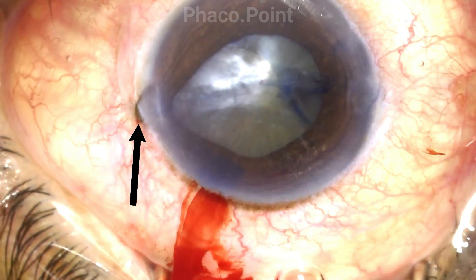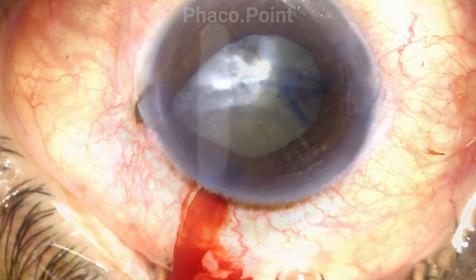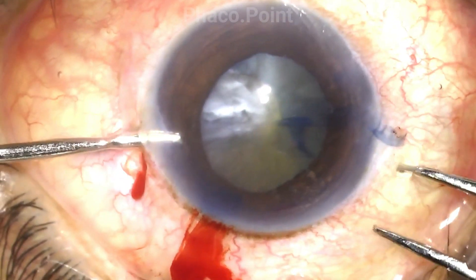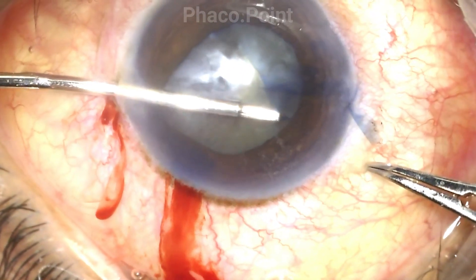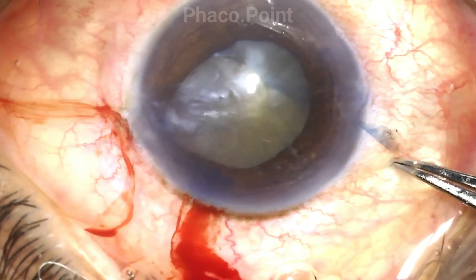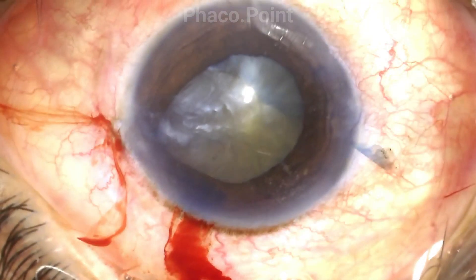I'd also like you to notice the tendency to iris prolapse from these rather large side port incisions. With the help of a little viscoelastic, the iris is repositioned, after which the intraocular forceps is introduced from the left side and the capsular rhexis is completed. You will notice that you've ended up with a fairly eccentric rhexis. A capsular rhexis like this could result in the nucleus tending to pop out superiorly, and there is imminent danger to the inferior rhexis edge with the phaco probe or the chopper, as it is much smaller and seems quite close to the centre.